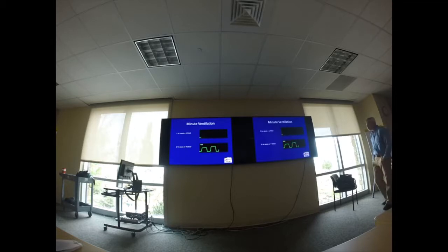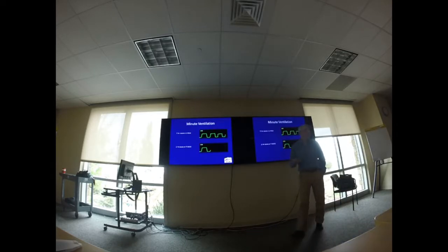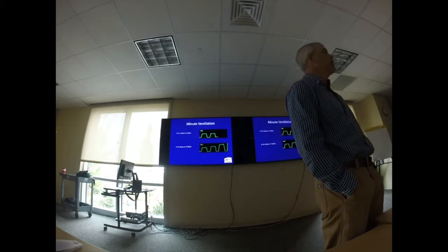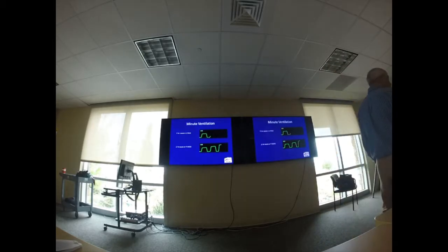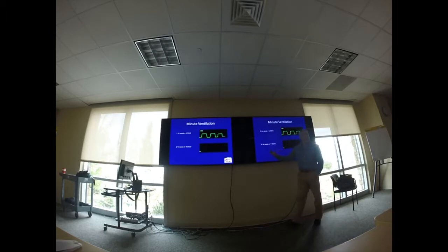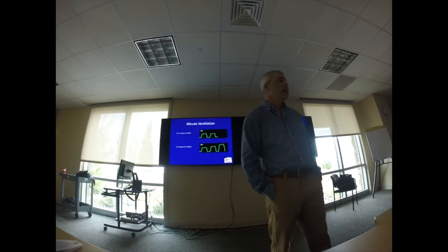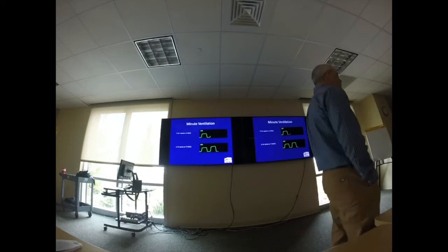So let's say their end-tidal CO2 is high, right? What would you do to your minute ventilation? Yeah, you would increase it to blow it off, right? So I would increase either my respiratory rate, probably primarily do that first, or my tidal volume to blow them down, right? So if I had an end-tidal CO2 of 48, and my respiratory rate was set at 10, then I would increase my respiratory rate to 12 to titrate or blow off my end-tidal CO2.